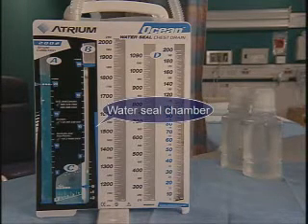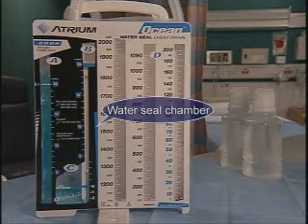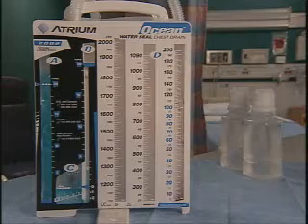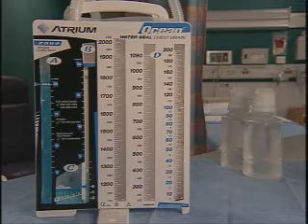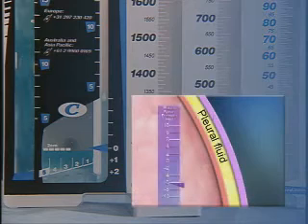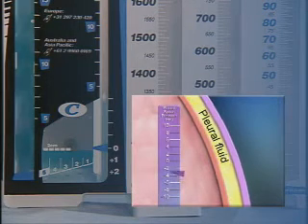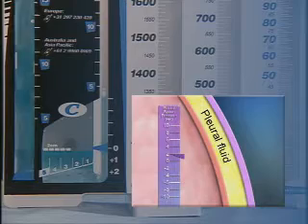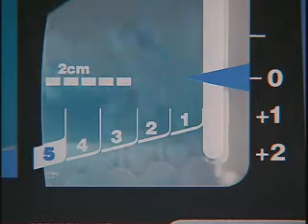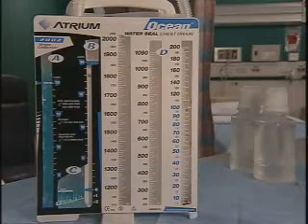The water seal chamber has a one-way valve to create negative pressure that lets air and fluid escape from the pleural space and prevents air from being pulled into the pleural space. The water level in this chamber reflects conditions in that area. For example, if pressure in the pleural space unexpectedly rises, the fluid level in the water seal chamber will fall. This chamber can also detect air leaks in the system or pleural space. In systems without a water seal chamber, an air leak monitor serves that purpose.